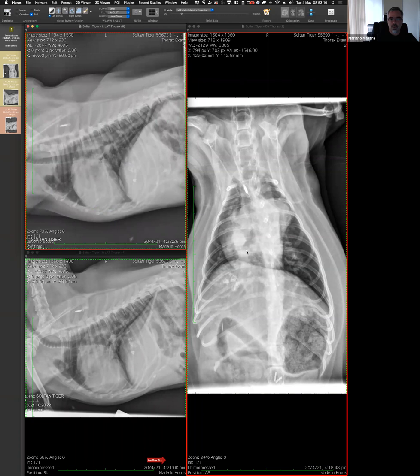Probably to clarify this even more, I will try to find an ECG gated CT in a case of enlarged pulmonary arteries, which I'm sure I have. And then we can review that anatomy. The anatomy of the heart base may be an interesting topic because there was this idea today about lymph nodes, and there are many other things that can go wrong there. And because we have the trachea and the main bronchi, I think we can learn a lot.